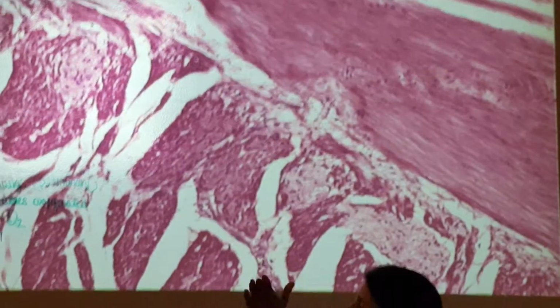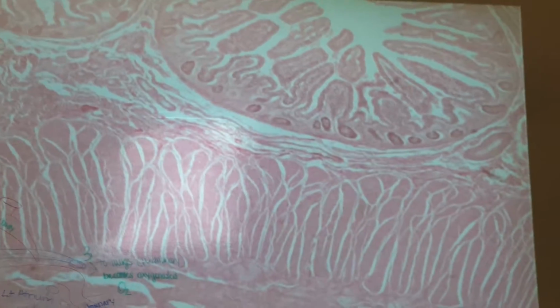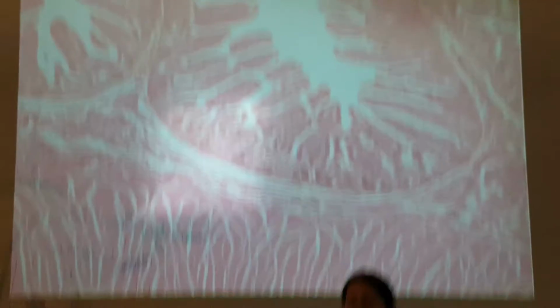The colon tends to be more organized in the muscle layer as well. And again, this is why I don't tell you to look at the color. Unlike the other ones, this is all the same looking one.